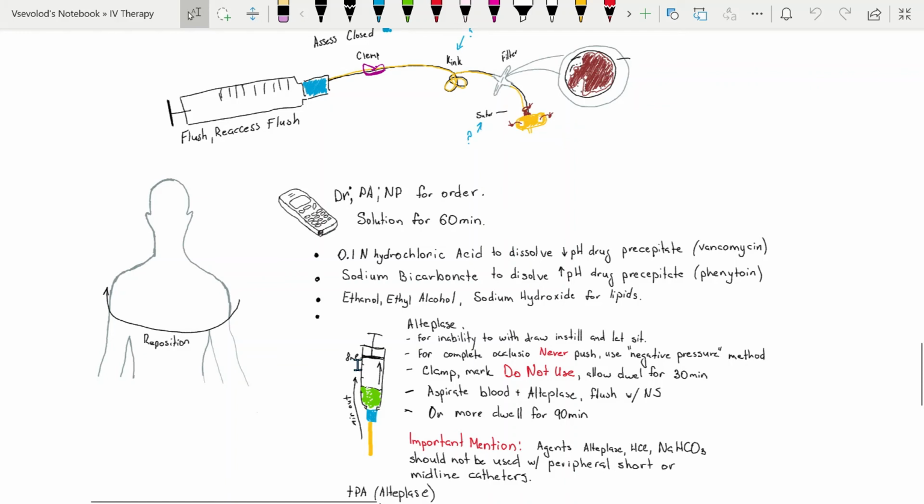release the plunger. This step may be repeated several times. The idea is to remove all the air from the central vascular access device, create a vacuum, and let the alteplase fill the catheter, that empty space.